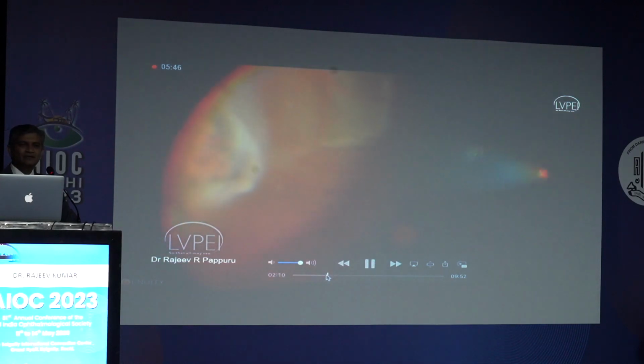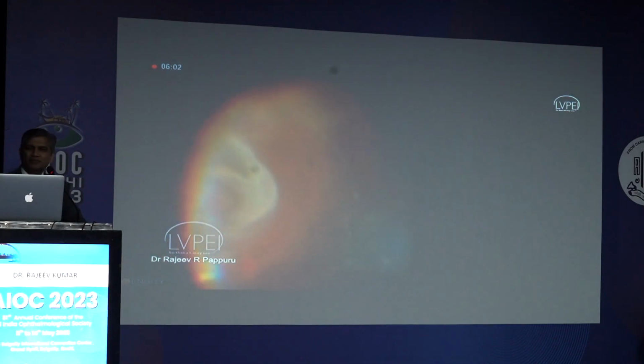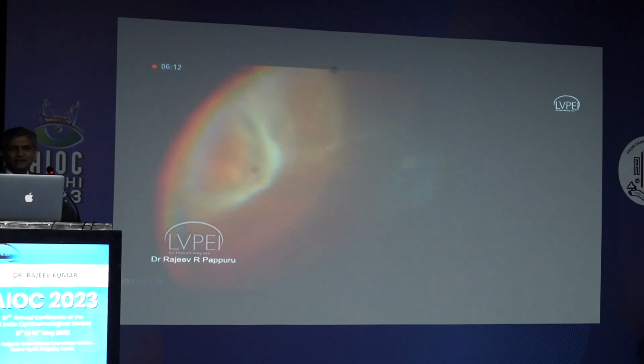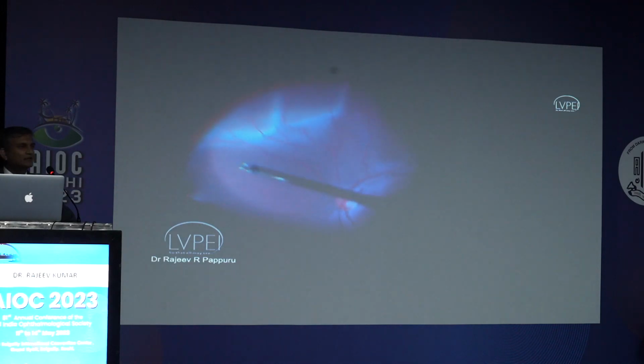But then we see this area. There was some vitreous left there and that has created a break. The retina was attached in less than 180 degrees. So, should I have done a base excision? This is a peri-silicone oil membrane which is floating. I still don't have an answer whether we should do a base excision with the phakic lens there. Nasal is the main reason, because I could not reach because of the phakic lens, so I did whatever I could through the nasal port. That's the one which has caused a break.